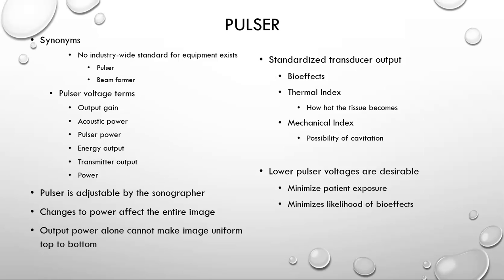So there's no industry-wide standard for any of these terms that I'm going to give you, so you're going to have to learn several terms for each component. We've already discussed how everything in ultrasound has multiple names. Well, this is where it really becomes important to know those, when we start talking about the different components, because one manufacturer may say, well, that's the beamformer and it's responsible for only shaping the beam, and the other one may say, well, no, the beamformer is also responsible for apodization and voltage strength, and a third one will say, well, none of that's true, it's all the pulsar. Well, it's all true for all of them.